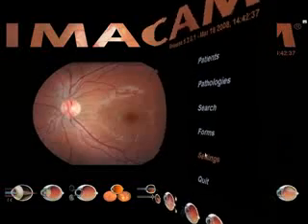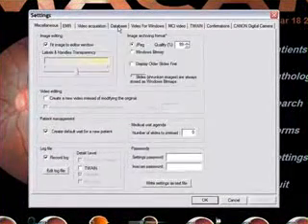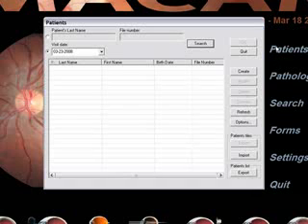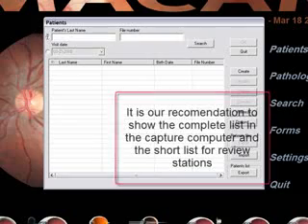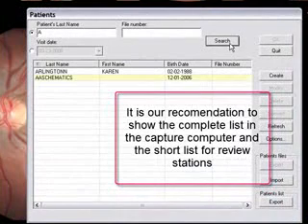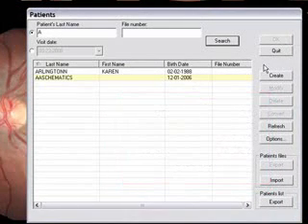If you plan on installing iMacam in your exam rooms, one simple tip is: go to Settings, go to Database, and uncheck the box that says "Show Complete List." This will allow only the patients that were there today to appear on the list, or you can search any patient.